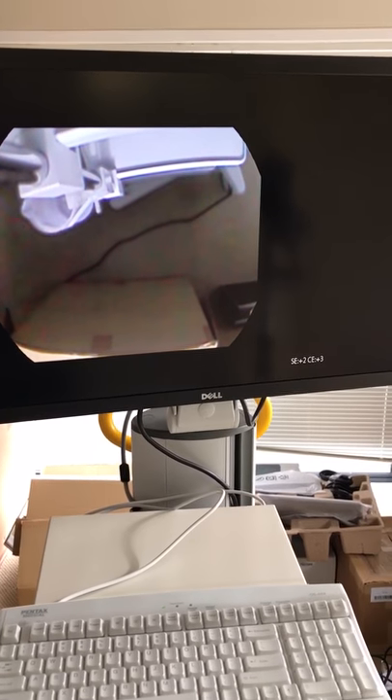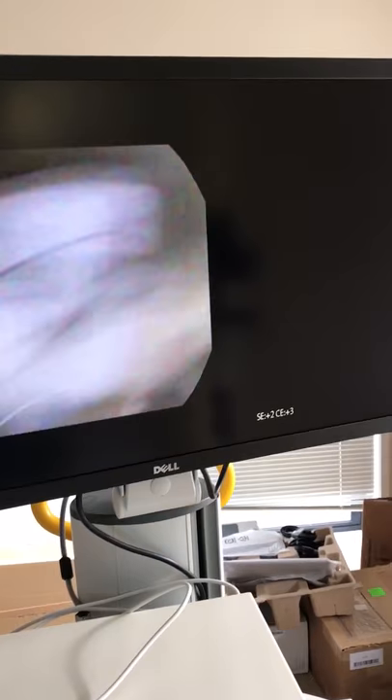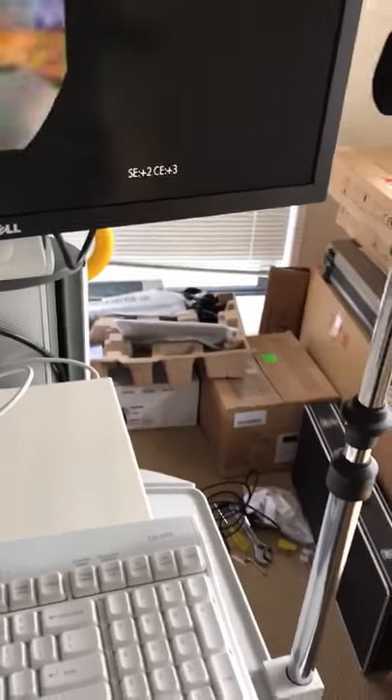You can see here that this is a pediatric scope and the image size is actually really big. I've got it at medium size at the moment — I could make it bigger, but I'll keep it this size. Now I'm going to try and demonstrate this — it's quite difficult with one hand. Let's have a look at this image quality with the videoscope.